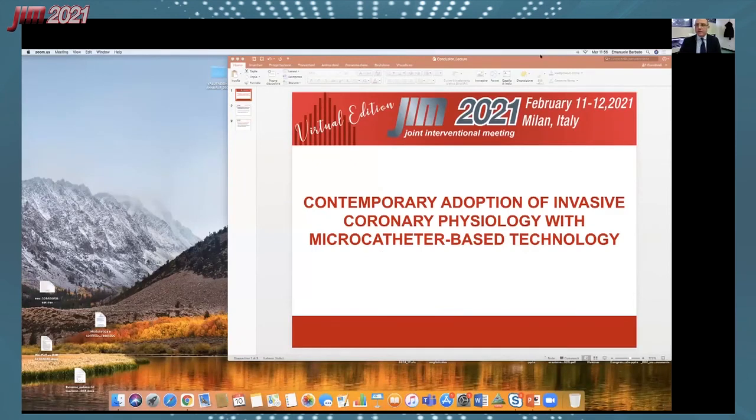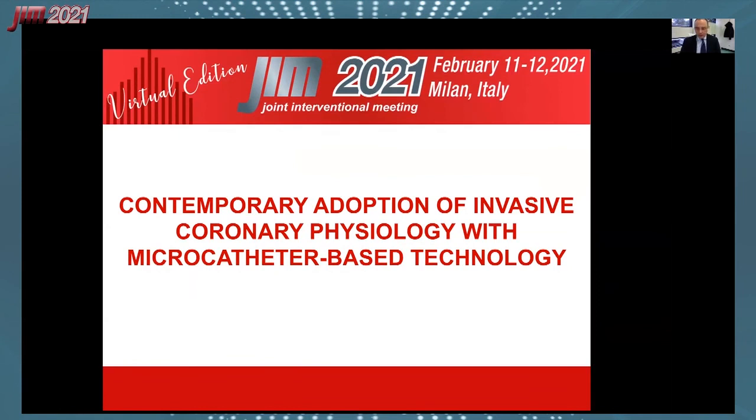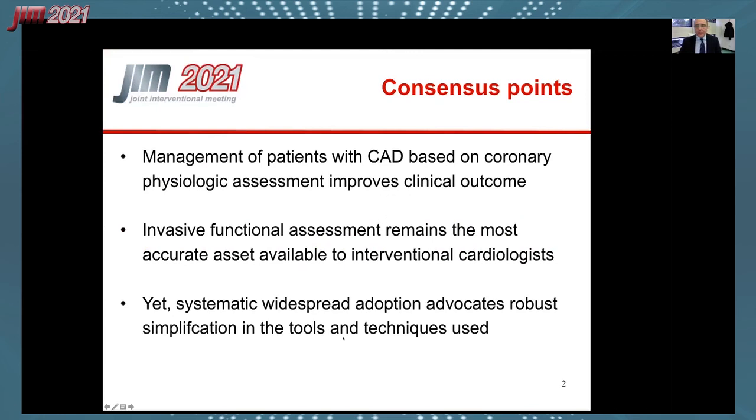Thank you. I think with your words, Luigi, we are ready to close this session, and I will share just a few slides that summarize what we just discussed and a few points of consensus on our session on contemporary adoption of invasive coronary physiology with microcatheter-based technology. These are the consensus points I feel we reached during this session. That management of patients with coronary artery disease based on coronary physiology assessment improves clinical outcome.